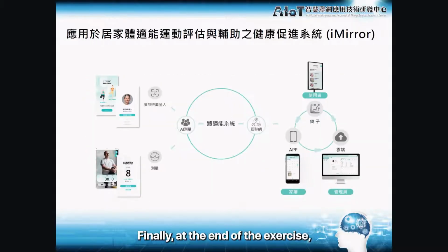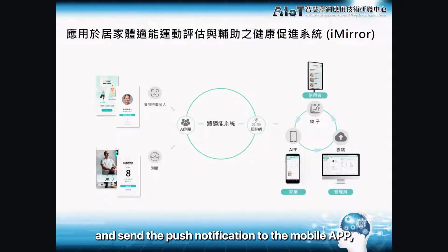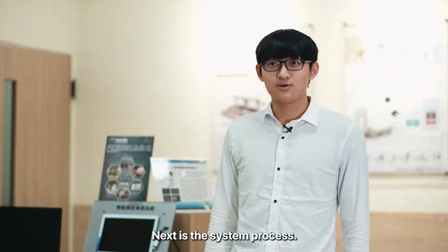Finally, at the end of the exercise, upload the exercise data to the cloud management platform, and send the push notification to the mobile app, so that the administrator and family members can check the elderly's exercise status. Next is the system process.